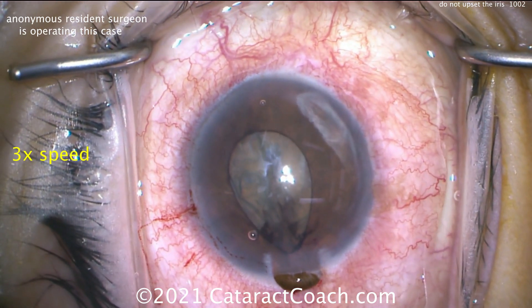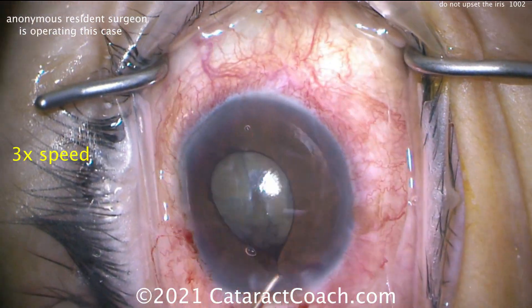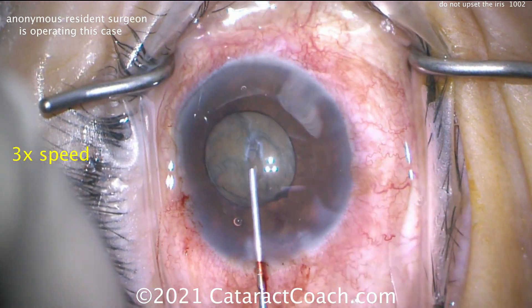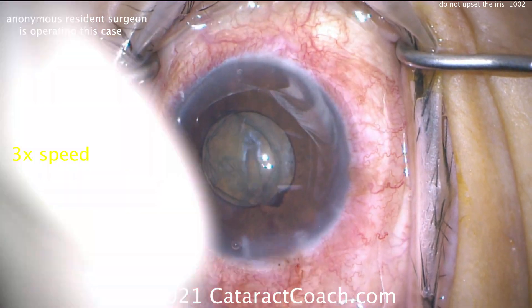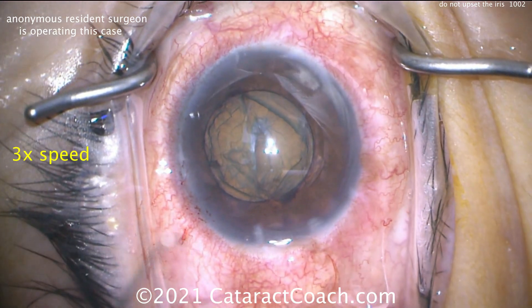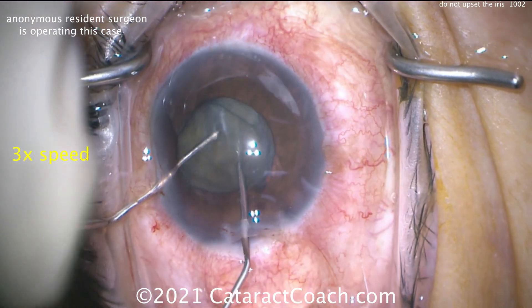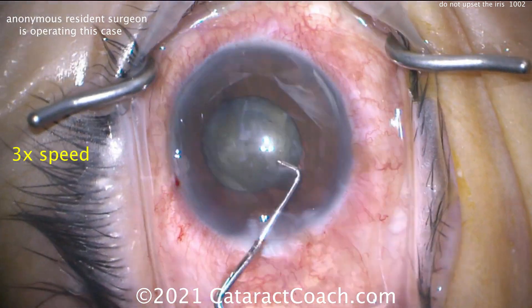Let's show you the whole case — we'll keep it at three times speed. Loosen up the speculum — I like that. Reposition the iris, release the pressure gradient, more viscoelastic on top of the tissues — I like that too. Now let's try again. A little more viscoelastic. The pupil's back to a reasonable size. Chopper goes in — can we chop the nucleus just with a chopper and try to break it into pieces? There you go, that's a help.